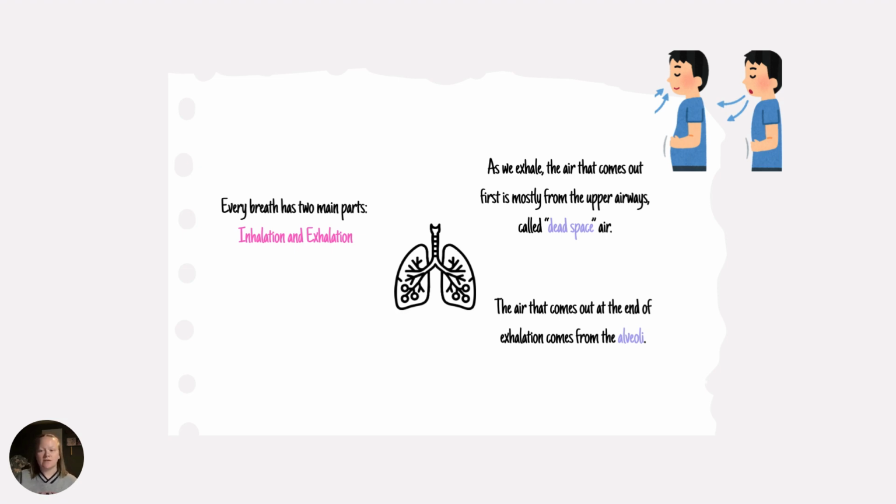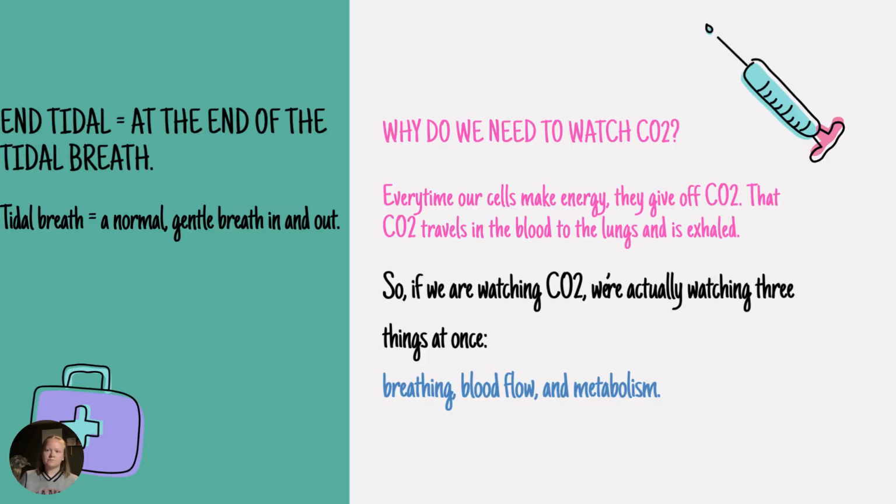The alveoli down here is where gas exchange happens. So that's where blood releases the CO2 into all the air sacs. This air has the highest concentration of CO2 of the whole breath. So why is it called end tidal? Well, the end tidal part just means that it's the end of the tidal breath. That's where it's measured. And a tidal breath is just a normal, gentle in and out breath.